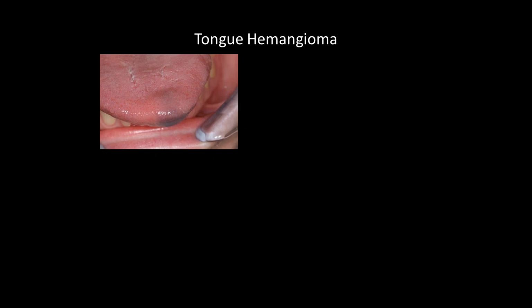And occasionally you'll get a crazy case that walks in your office. This is a patient that was referred to me by another dentist who knew that I used lasers. This patient had this lesion going on for at least 20 years, she said. Her consultation with her doctor told her that what they would have to do is section a portion of her tongue to treat this. So you can see why she had this for 20 years.